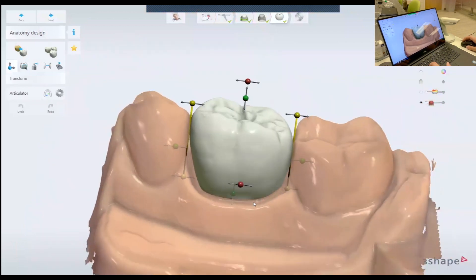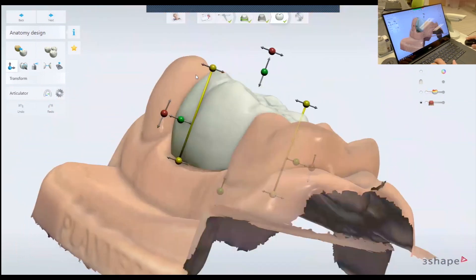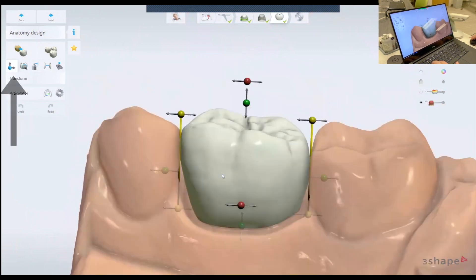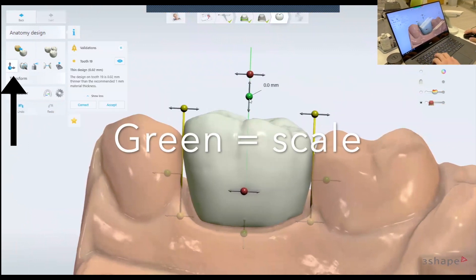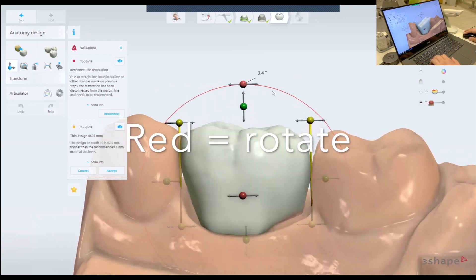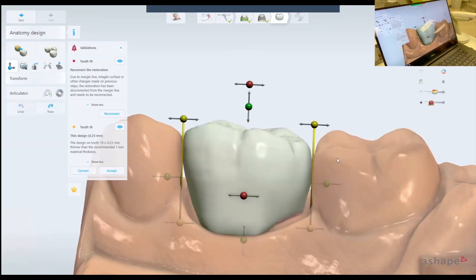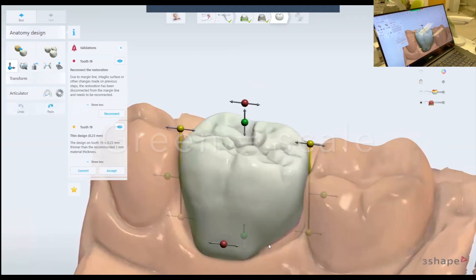The software will propose a design for you. When you look at the design, there is the transform tool. The transform tool has buttons that will elongate the crown, rotate — the red button will rotate — the yellow button will taper the crown like this, and the green will scale it like this.